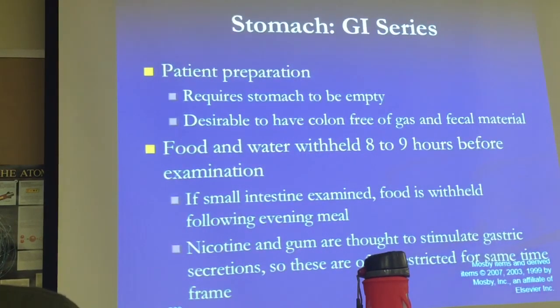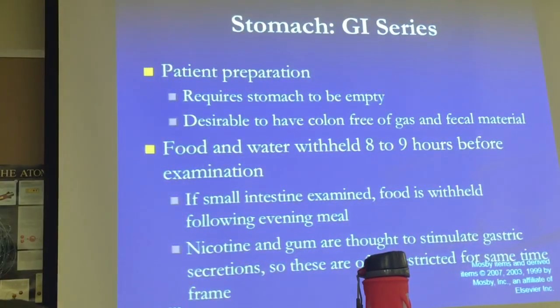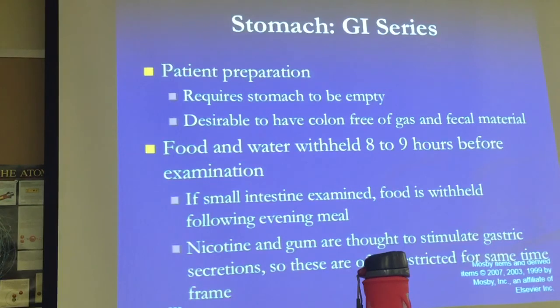Okay? But don't give them a Snickers. Don't give them Snickers. Yeah. If the small intestine is examined, food would hinder the exam, so nothing after the evening meal. So nothing after last meal, and typically that meal will be a light meal, maybe some tea, something very, very light, something that is not going to create a lot of gas or fecal matter. Okay, something just light. All right, and so they're going to be even more upset.